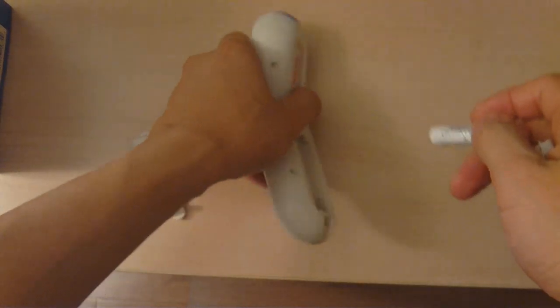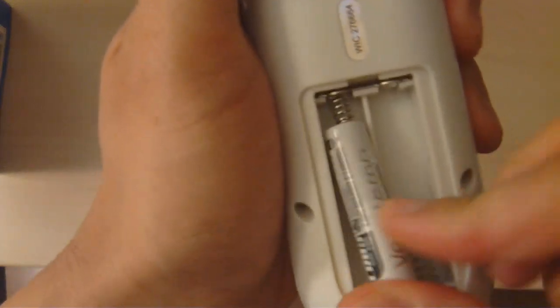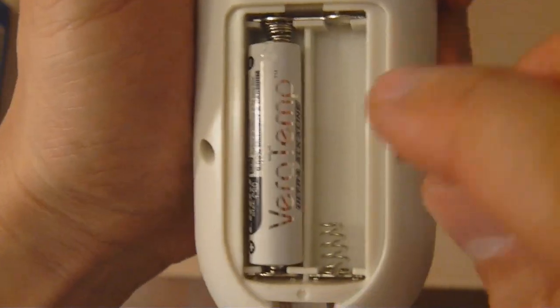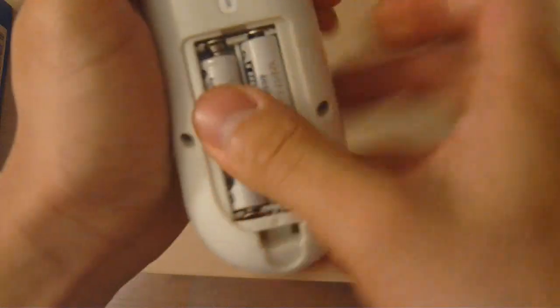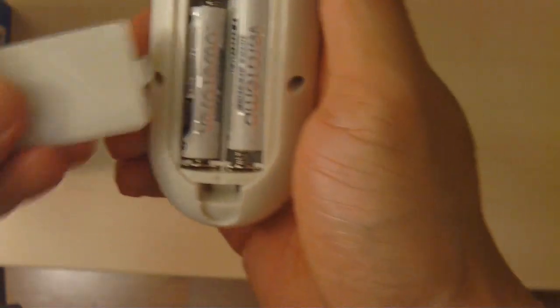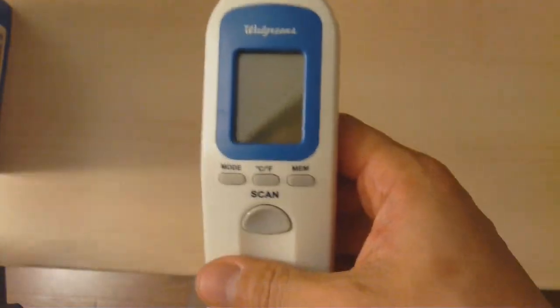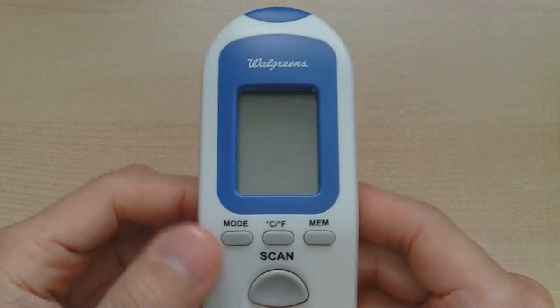Let's put the batteries in. We'll observe the polarity here and make sure we do this right. The negative end goes there and the positive end goes here. The two Veritemp batteries are in — we'll just close this up. We can remove the sticker because without it we can't see the display. Now that we have the batteries in, let's power up the device and see what we can pick up.